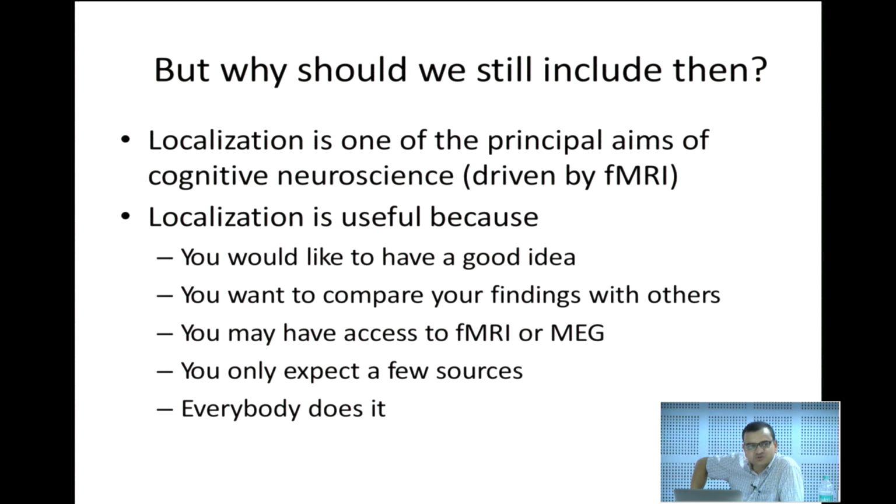And the last one, which is rather unhealthy, I would say, is that everybody does it. I would not say that is the best reason to do it, but when you are in the system, you have to play by its rules. If you want to make a stronger impact in the field, then at some point you really have to go from sensor space to source space. Okay.